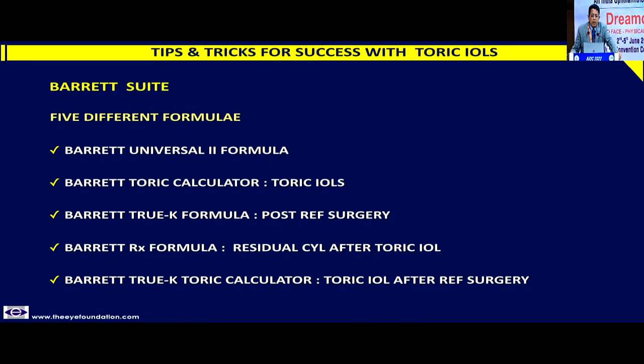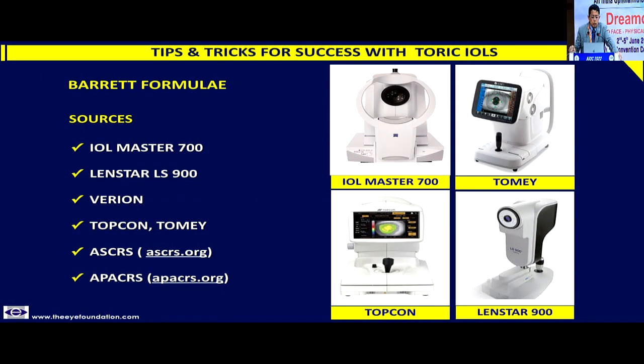The go-to formula today when my patient comes into my clinic is not Barrett Universal 2, but the Barrett toric calculator. That immediately tells me whether the patient primarily needs a toric lens or not. Because what we experienced earlier was that there was not much corneal astigmatism, not much astigmatism in the glasses, and the patient used to agree for a multifocal intraocular lens. Then we put him on the biometer and find that the patient has significant toricity. So today the first thing we do is look at the Barrett toric calculator, then counsel the patient according to whether it's non-toric, monofocal toric or multifocal toric, so that you are not changing your words once the counseling has started, and it seems to work very well.